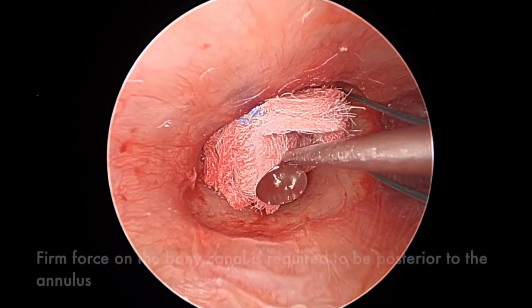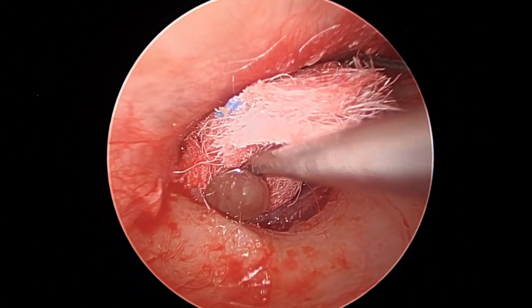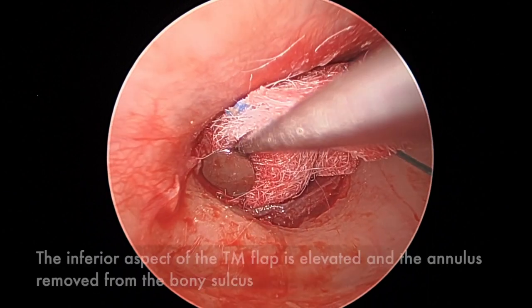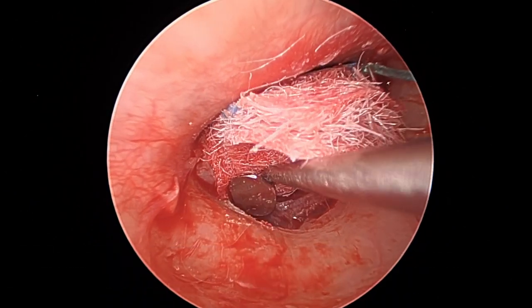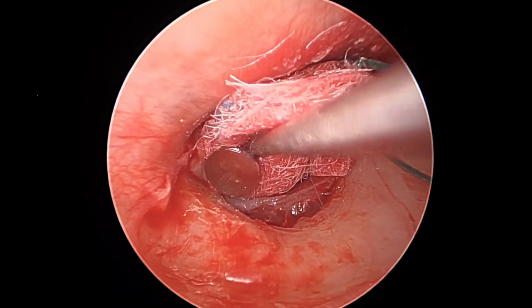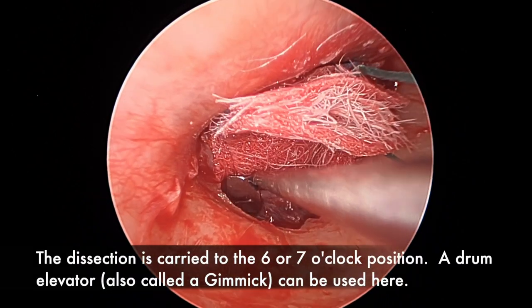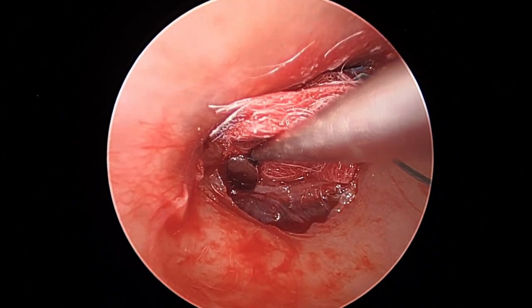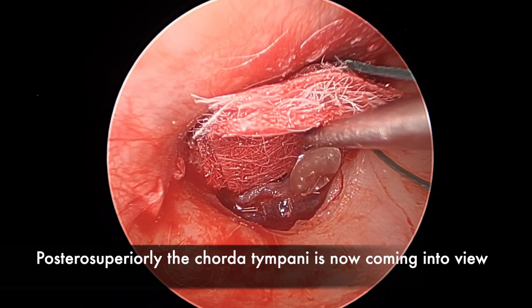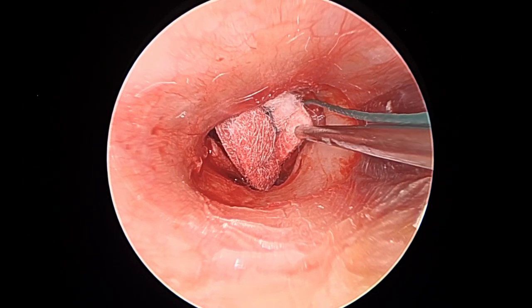One strength of the endoscope, particularly posteroinferiorly when there is a big overhang, is that you can often deliberately see the annulus which you can't see microscopically. With a little blood but the annulus visible, I don't need to switch to the microscope yet. The parallel incision ensures that when pushing, the incision stays away from the annulus so it doesn't tear. The mucosa is elevated and we can start to see the chorda tympani coming up posteriorly with an attached long-type configuration — a classification published by Uranaka et al., useful for recording cases and correlating to chorda injury.